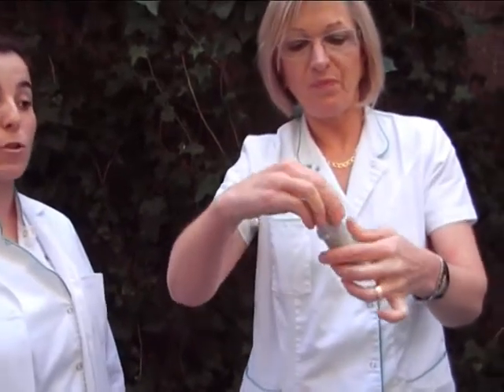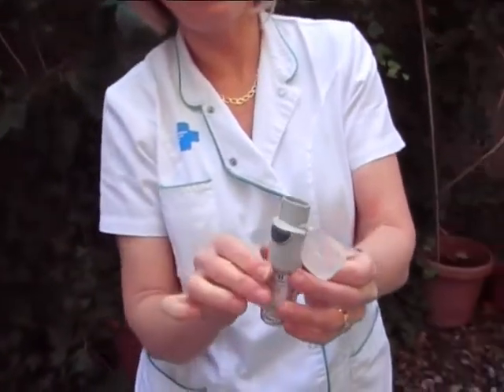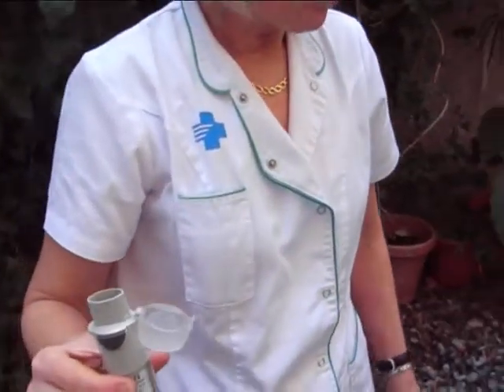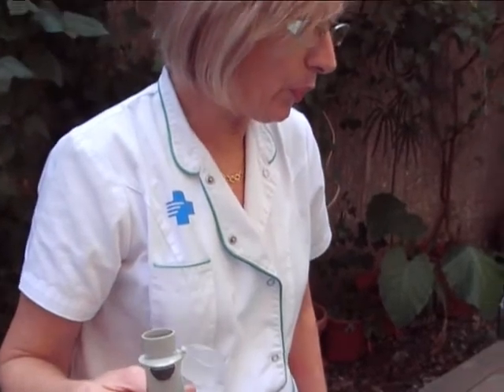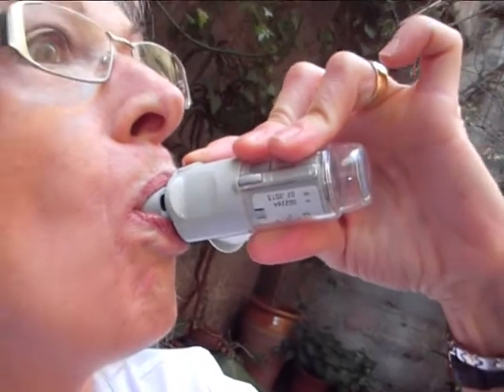Twist the inhaler in the direction of the red arrow until you hear a click. Open the cap and breathe out while turning your head away from the inhaler. Place the inhaler between your teeth and seal with your lips, making sure you don't cover the air vents. Press the dose release button and inhale fully. Hold the air in your lungs for 10 seconds and breathe out slowly.